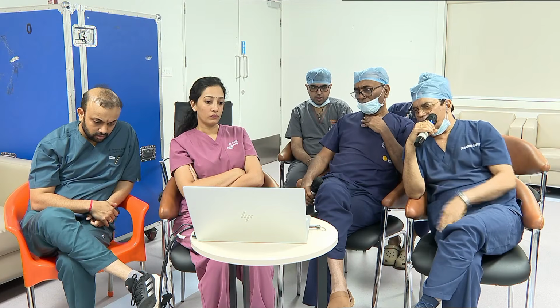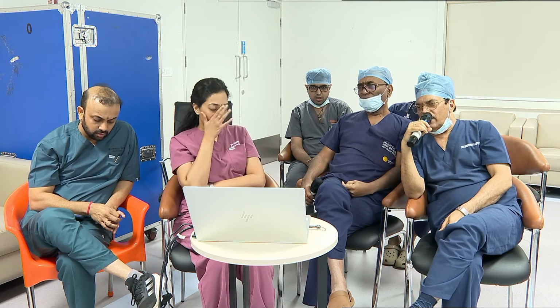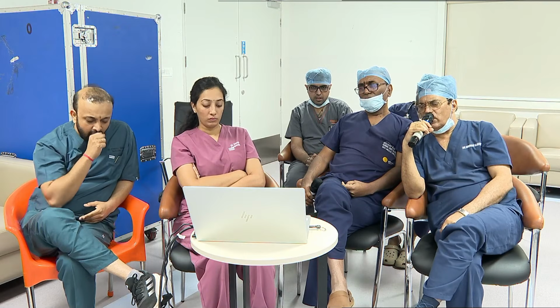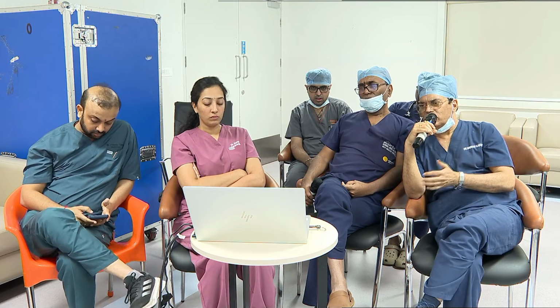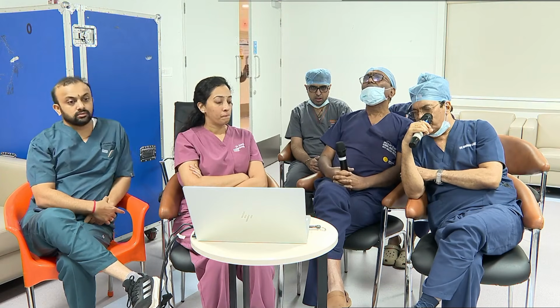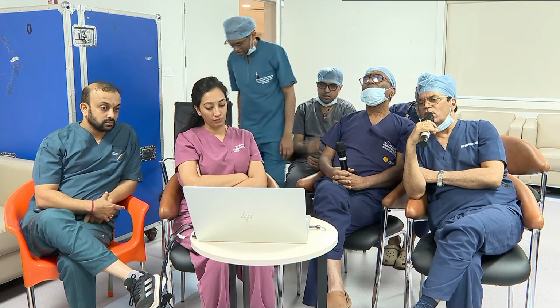So here, one of the advantages of this device is delivery. Another one is it has three markers, mainly for the cuspal overlap view. So what you are doing, you are overlapping the right coronary cusp and left coronary cusp, and separating the non-coronary cusp, so that when you use a cuspal overlap view, the pacemaker chances, involving the conduction system, are very low.